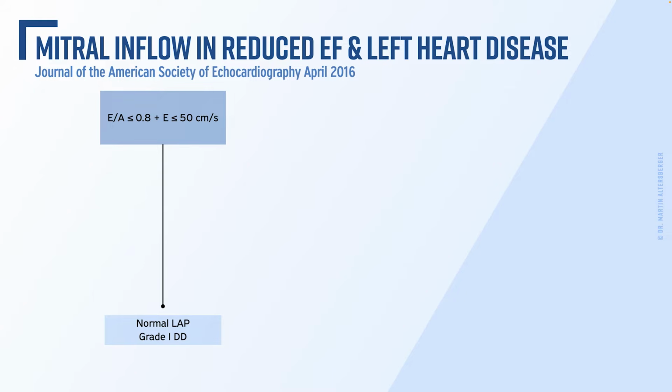And we define it with a number, grade 1 diastolic dysfunction. For me personally, it's very important to denote that filling pressures are normal. So left atrial pressures, left ventricular end-diastolic pressures, that's actually a synonym without mitral stenosis, filling pressures are normal.